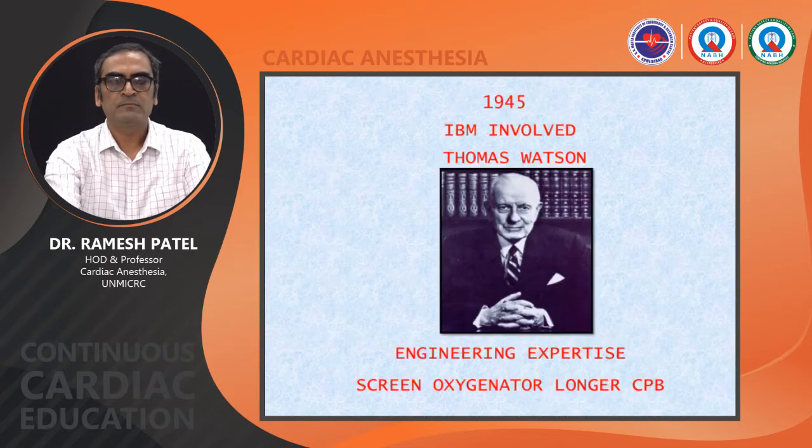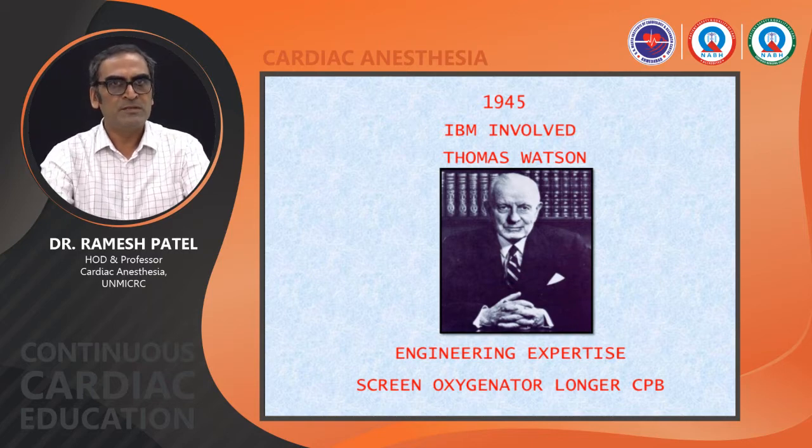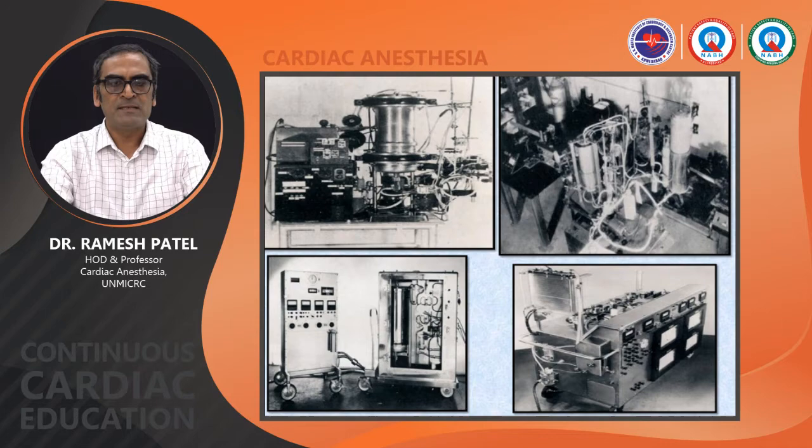In 1945, Thomas Watson, the chief of the IBM company, involved some engineers from IBM to develop a heart-lung machine. We can see photographs of the heart-lung machines used previously. They were quite big in size and quite complicated to assemble.